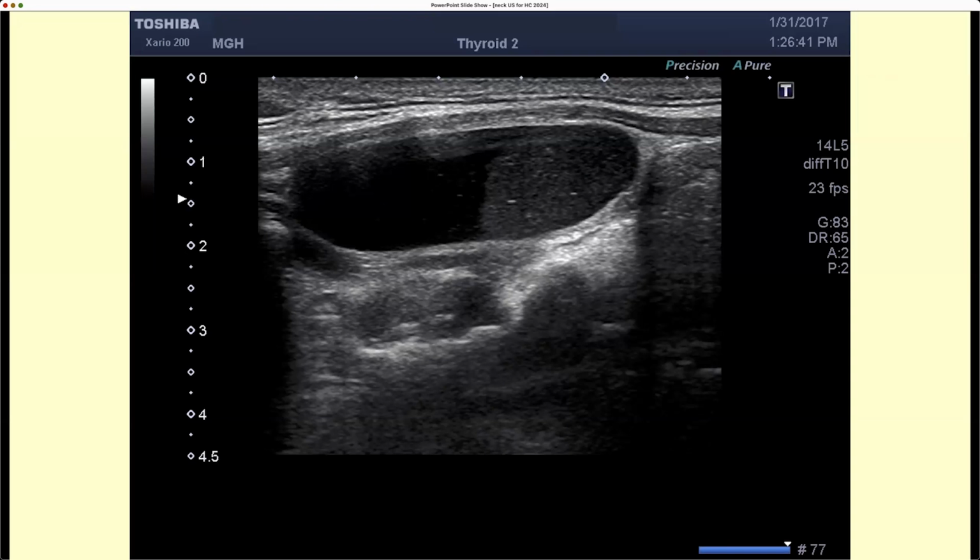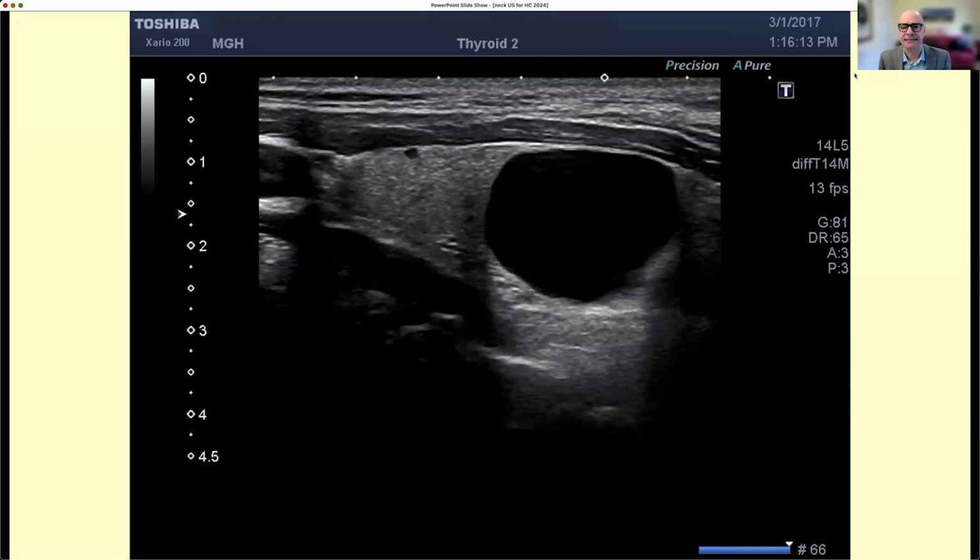Vascular flow? Yeah, we turn the Doppler on. If there is no Doppler flow, this is not tissue. So this is a cyst with inhomogeneous content. Or if there is flow here, then we have to worry about some hypoechoic material that is vascular, therefore live tissue within the nodule. Unlikely. Most likely this is a cystic nodule with different density of the material inside the cyst.